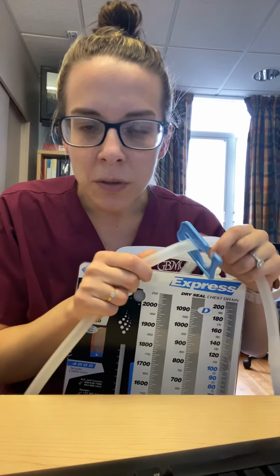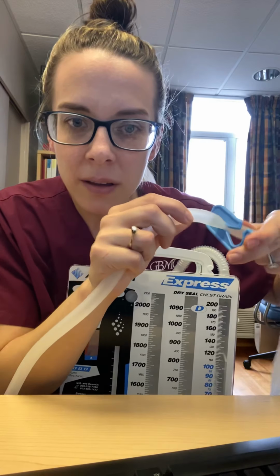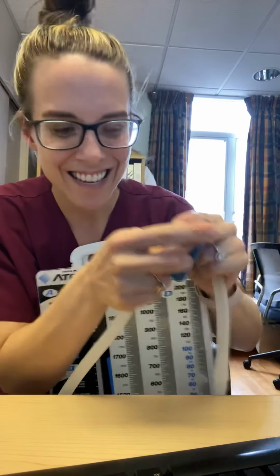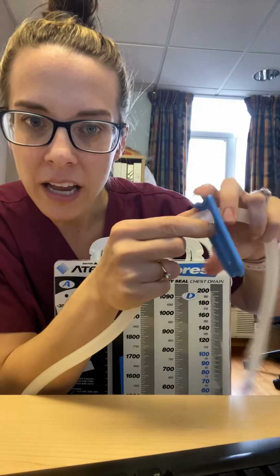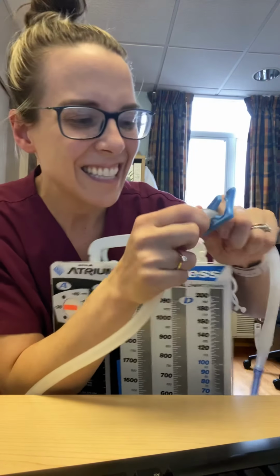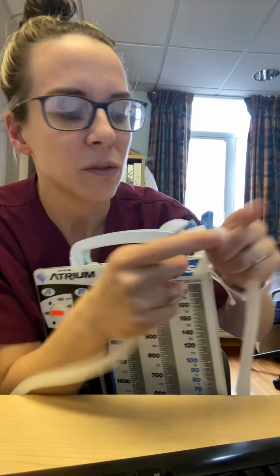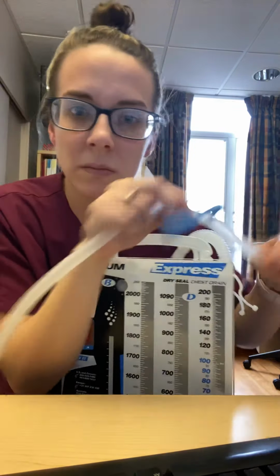Again, something that when you're troubleshooting chest tubes during the day, during the night, make sure that that clamp is not clamped, that it's in this big part. And again, it just slides on that silicone tubing. So I'm sliding it, it's kind of hard, this way. Now it's clamped, sliding it this way, now it's not. Okay, so make sure it's not.